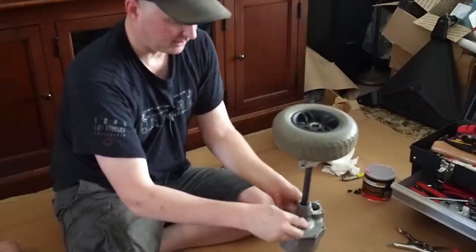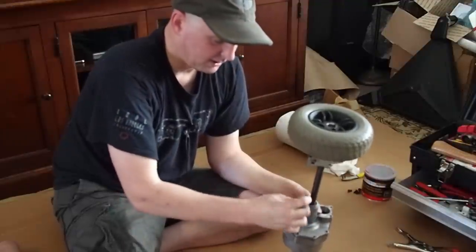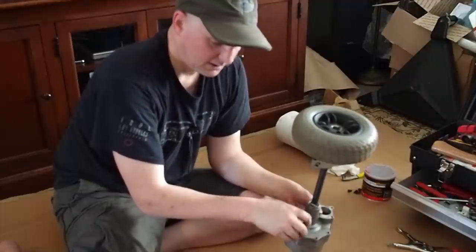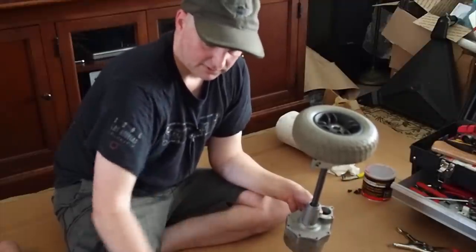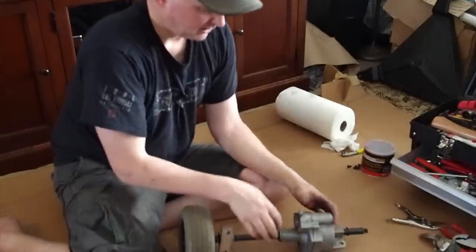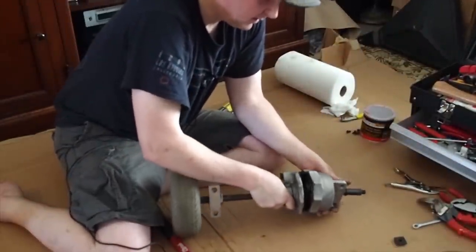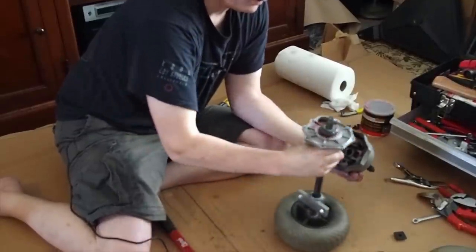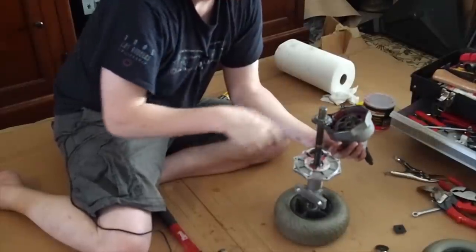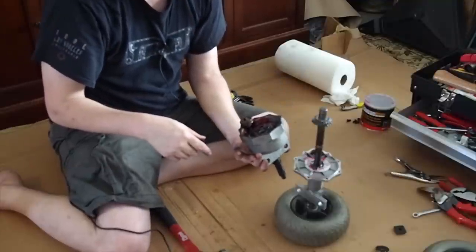I'm going to keep this closed while I take this last bolt off. I'm just holding it down below so that it doesn't fly apart on me. You have transaxles in front wheel drive vehicles because the engine is right there, and the transaxle goes directly to the wheels. So I can start taking this apart, and it'll have all sorts of gears. You can see there's a gear right here. I'm going to leave that one on, and there's the rest of the assembly. And my gear oil is still intact in there.